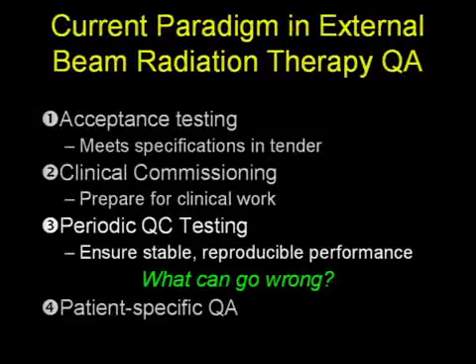Okay? So now the third step in this quality assurance paradigm, again outlined by the AAPM TG40, is periodic quality control testing. Again, this is just to ensure that the performance of the device is stable and reproducible. And again, I would like to make a distinction. Quality control, in my mind, excludes specifically those tests that are mandated by regulatory bodies such as the NRC or CNSC. And these, of course, need to be done no matter what, and should be considered separate from quality control in the context of this lecture.